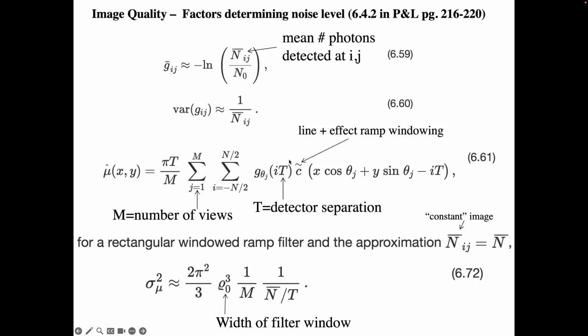And that assumption is that the mean value that we're looking at a particular position, that this image has roughly equivalent or similar values. So we don't have great oscillations in the amplitudes. And you say, well, that's not a realistic image, right?